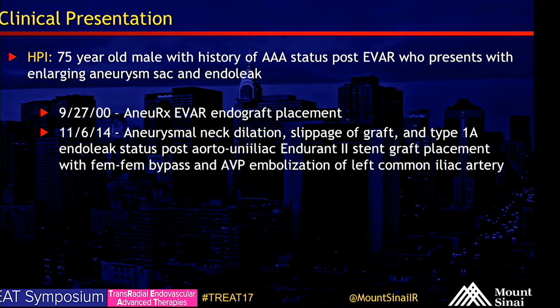stent graft placed. 14 years later, the stent graft had an aneurysmal neck dilation, slippage of the graft, and a type 1A endoleak, at which time he underwent an aorto-uniiliac Endurant 2 stent graft placement with a fem-fem bypass and had AVP embolization of his left common iliac artery.